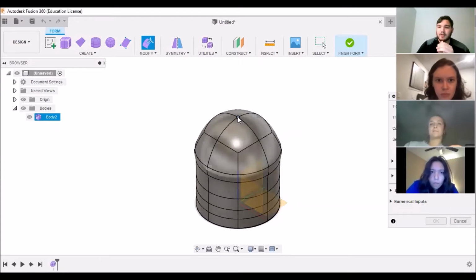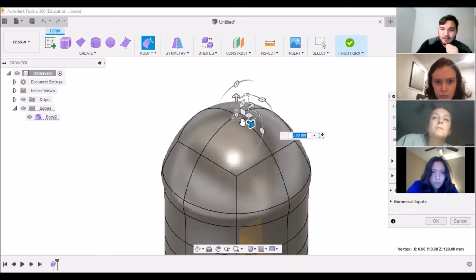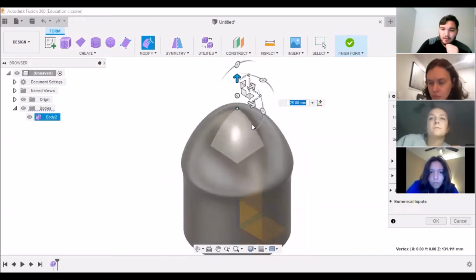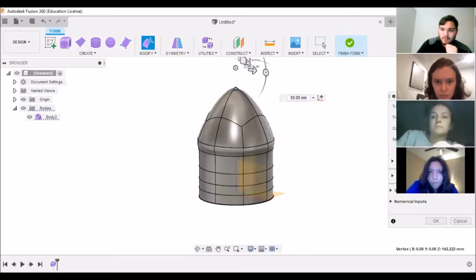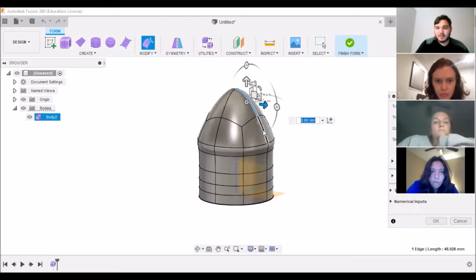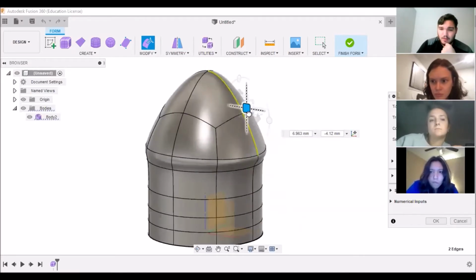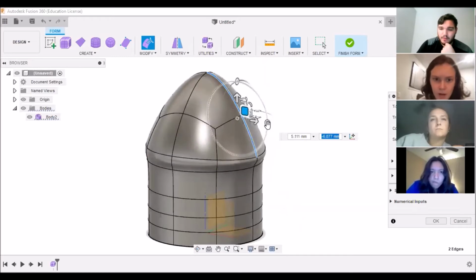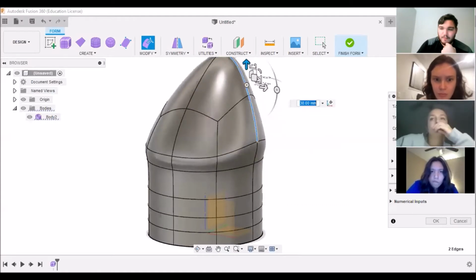So let's say I want to make a thumb, right? The thumb, at least in a hitchhiker's thumb, is a little bit more up with a flatter thumb tip, right? So let's select just the top vertex, and you can drag that up. Okay. We can also modify these edges. So instead of double clicking, you can hold Control and pick multiple edges at a time. Here, I can rotate it, extend it out, make essentially a fingernail almost.